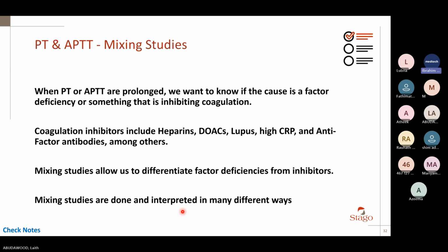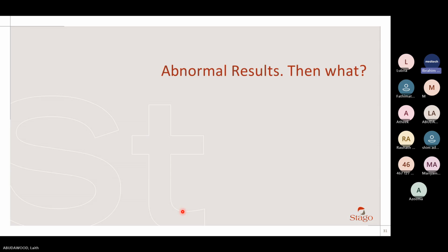Wait, question, Anita. Yeah, okay. Oh, it's not a question actually. I just want to maybe correct. Actually, with dialysis patients, what will be the best time to take the sample, after dialysis or during? Dialysis patients, when will be the best time for sample collection? What are you looking for exactly in the dialysis patient? Maybe there can be heparin contamination, right? That's actually what I want. Heparin contamination might interfere with the results, right? Absolutely, absolutely. So he's asking, for dialysis patients, what will be the best time to take samples? Because of heparin contamination.